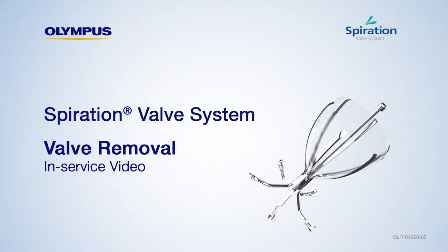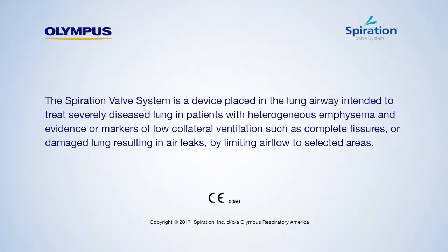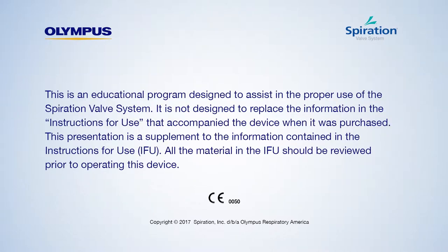Welcome to the Spiration Valve System valve removal in-service. Today we will review the proper steps for removing the Spiration Valve. It is recommended that valves should be removed through an endotracheal tube or other intubation system that facilitates access to the airways.